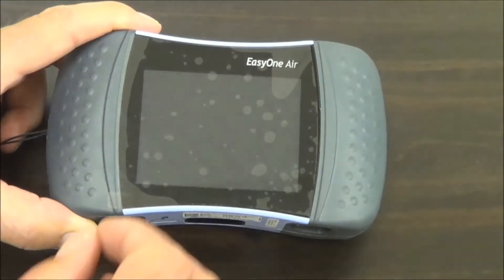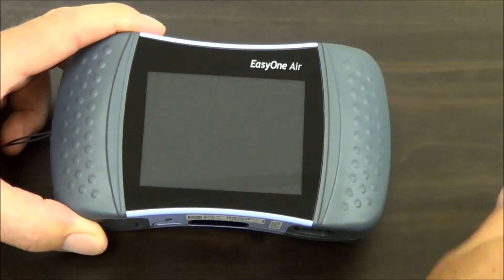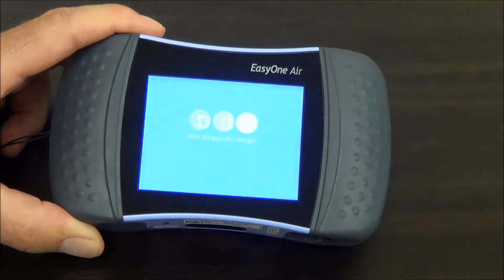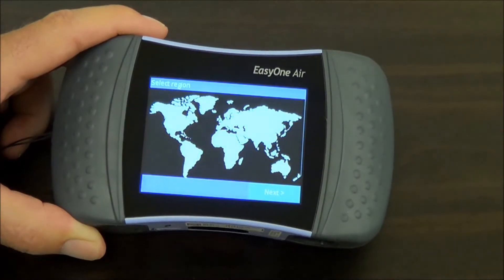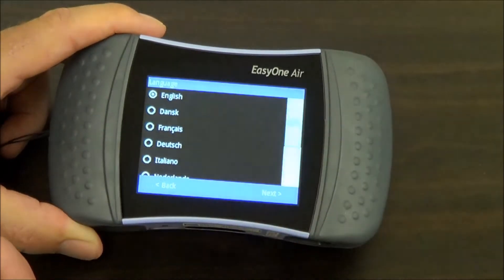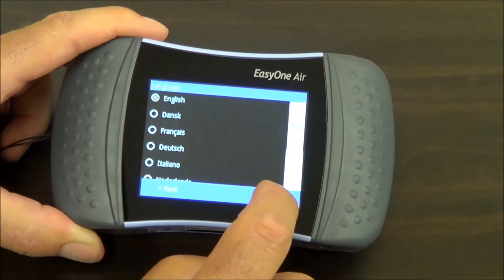Now we're going to turn the device on and set the initial configurations. First I'm going to remove this protective film. The power switch is up here on the top right. The first thing you're going to see is a world map, so you can indicate which area of the world you're operating from. I'm going to choose North America and hit next. Many languages are available — I'm going to leave it set in English.